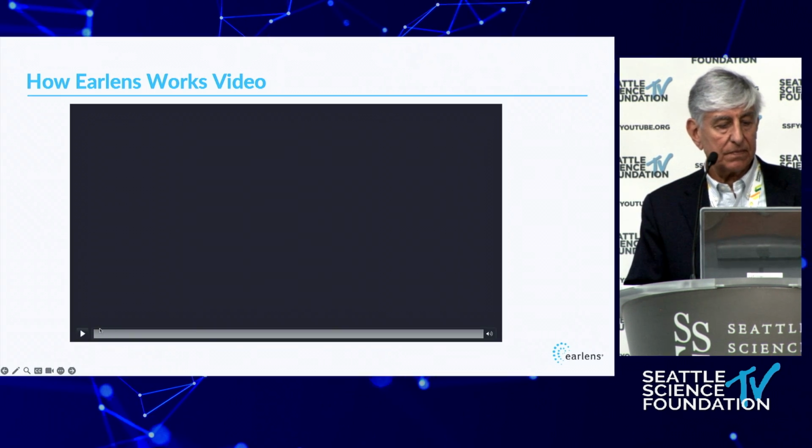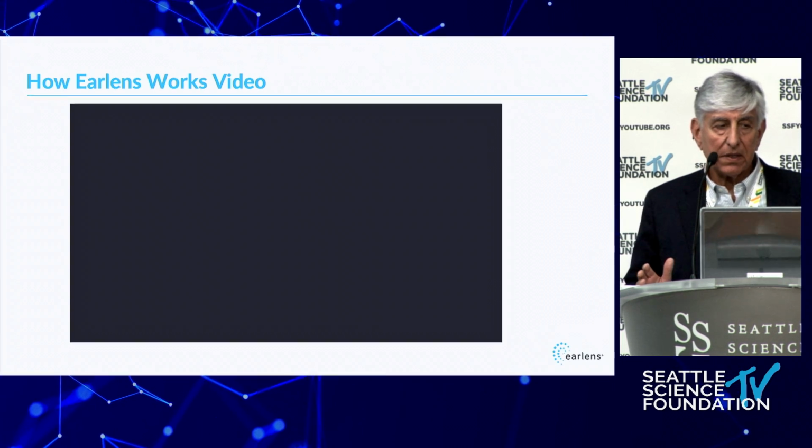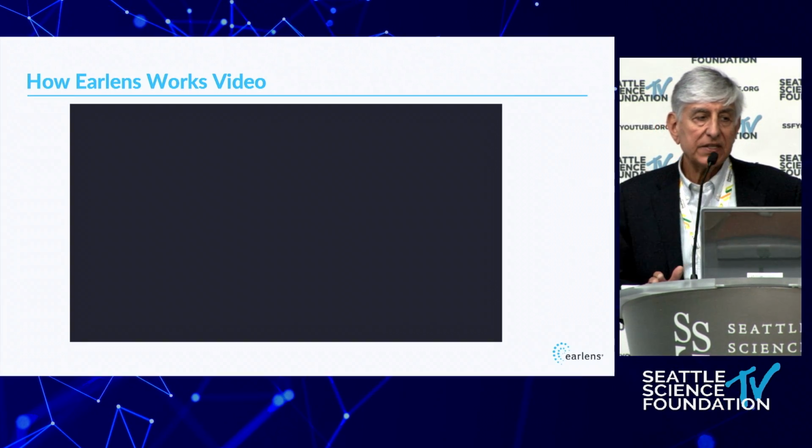Yes, sir. How long does the whole process take? And then in terms of billing, how... So the process takes patients, I have them try a traditional hearing aid so they know what it's like, and if they just love it and they think that's the cat's meow, then we'll end it there. If we have those select patients that want better hearing improvement, I make a mold. It takes 15 minutes for each ear because you have to clean the ear, then you make the mold, and it takes 11 minutes to set up on one side, 11 minutes for the other side. Send the mold, and we get the actual device back in 2 weeks.